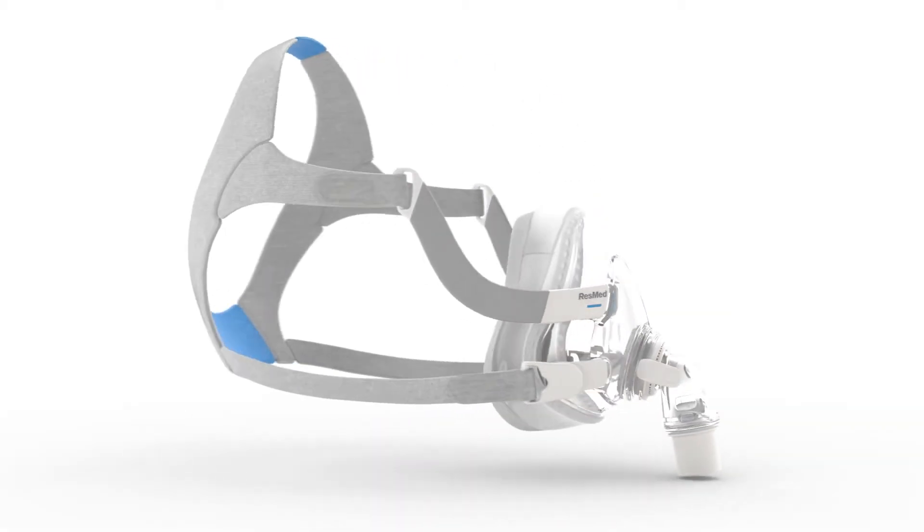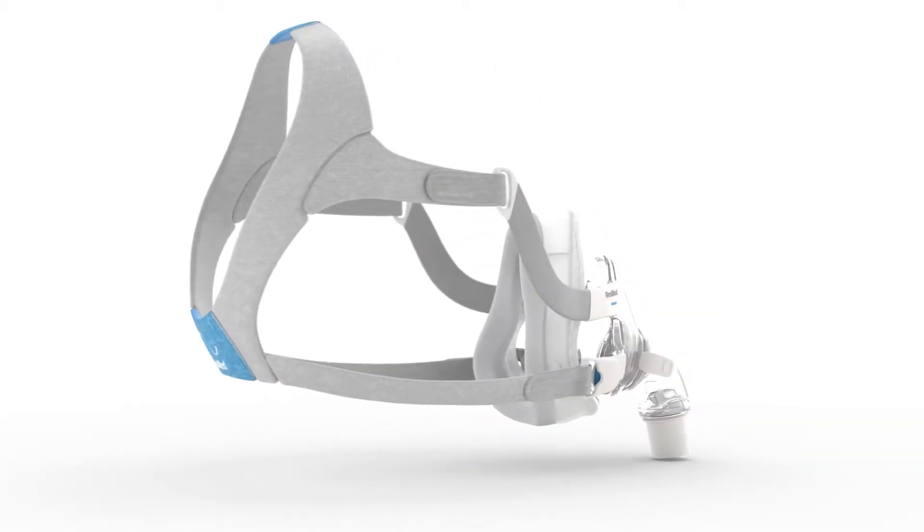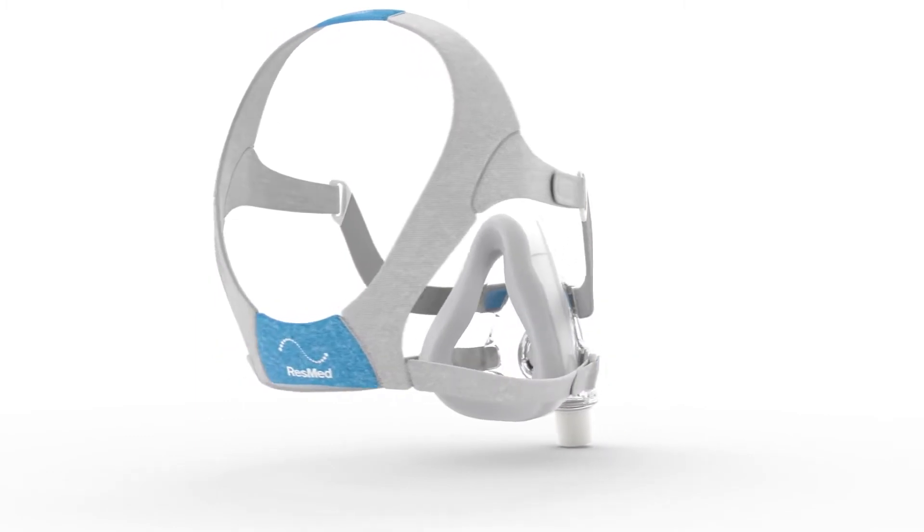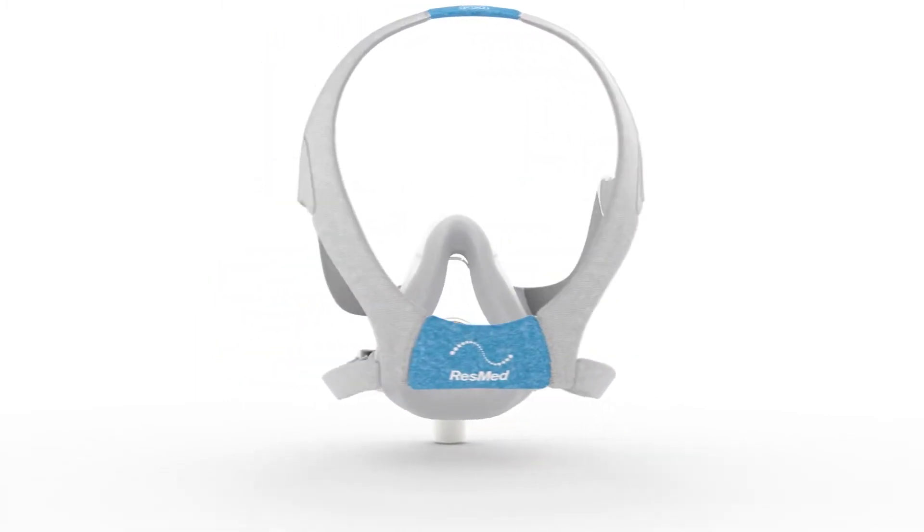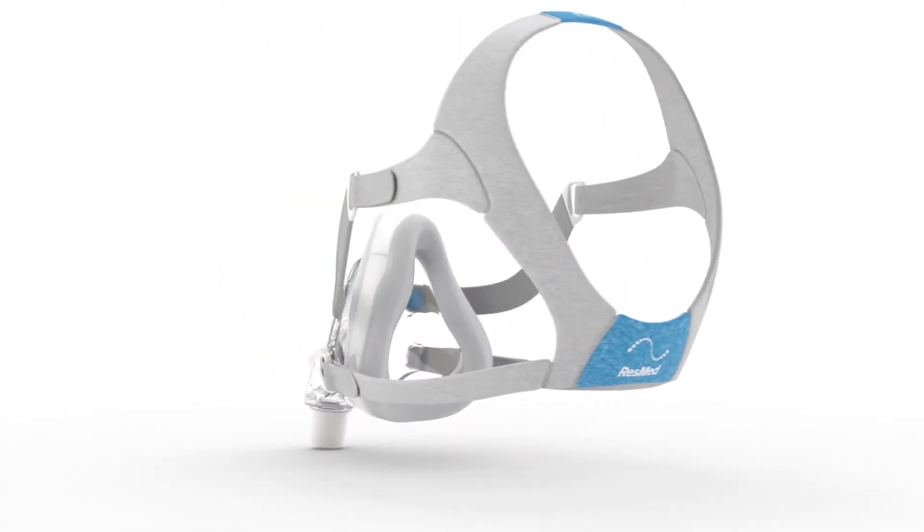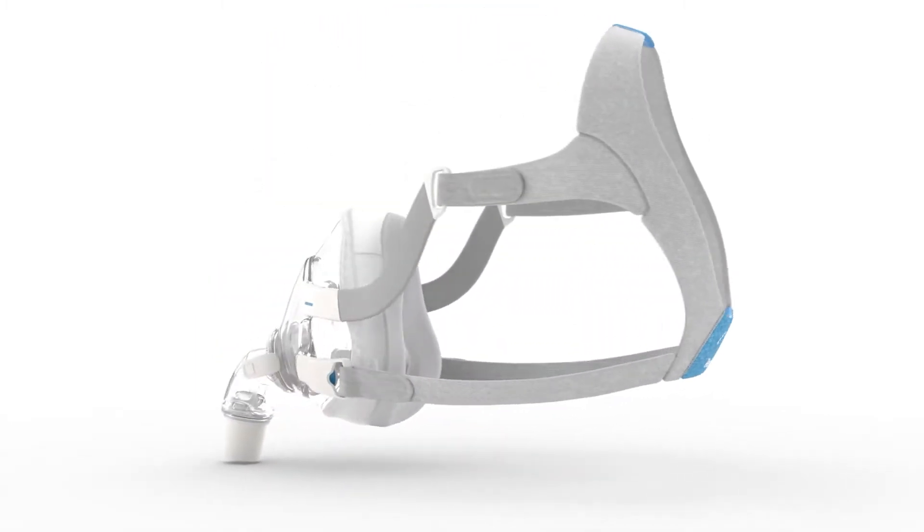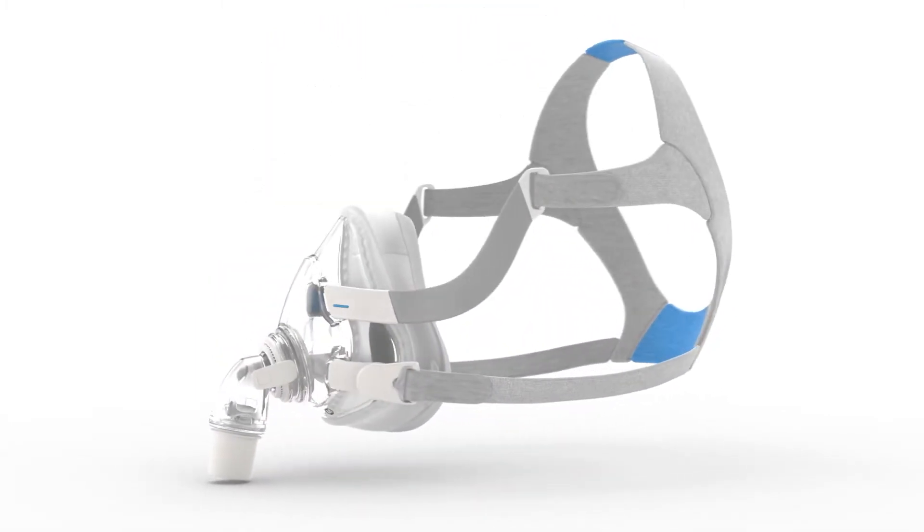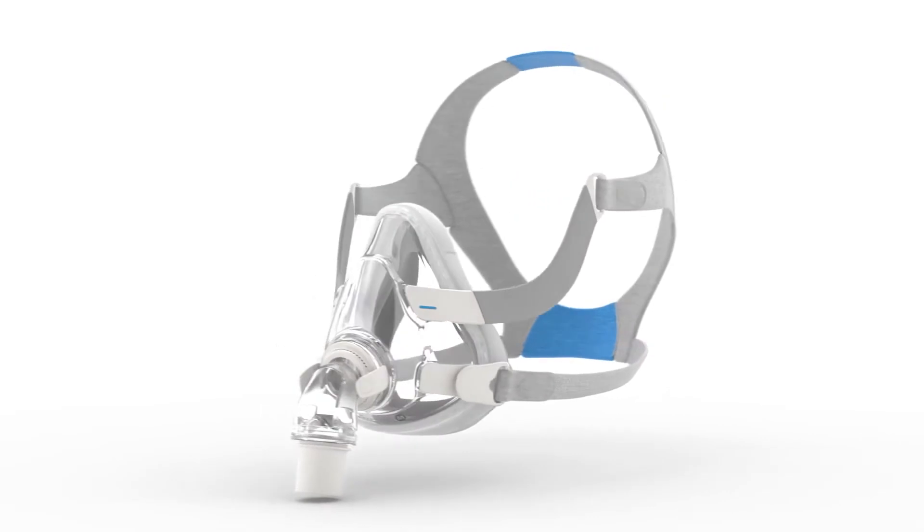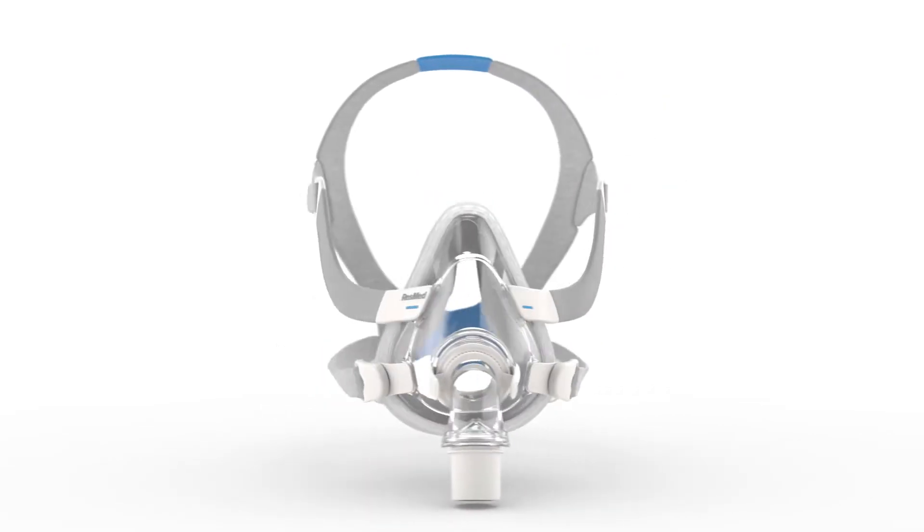ResMed's Airtouch F20 represents our softest mask ever, designed to deliver exceptional seal performance and a pioneering approach to patient comfort.